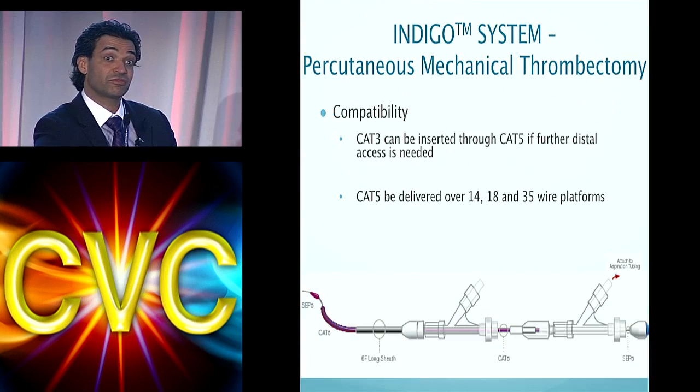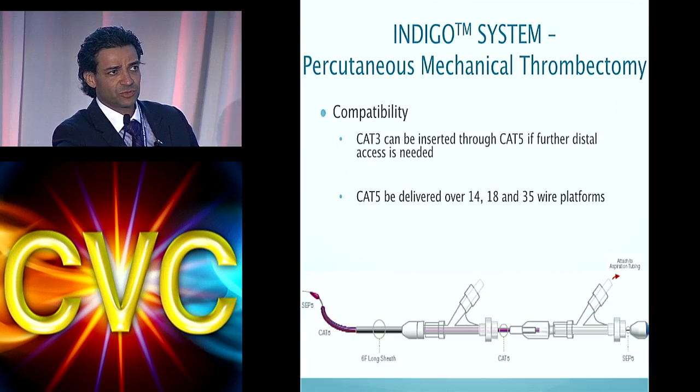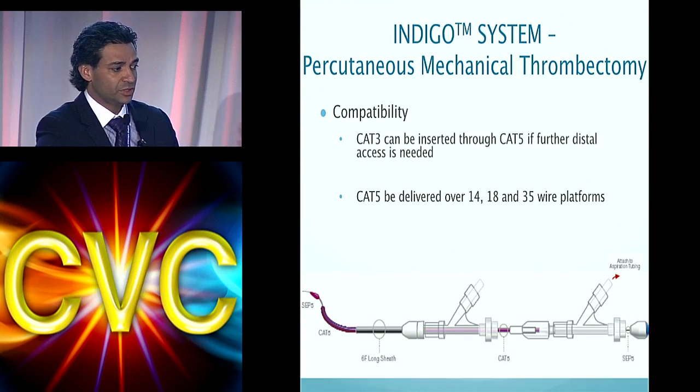Now, if you need to go even further, let's say you accidentally do push it down in the foot, or something happens where you're working the pedal arteries, well, you can put the Cat3 through the Cat5 and go even further downstream into the foot.